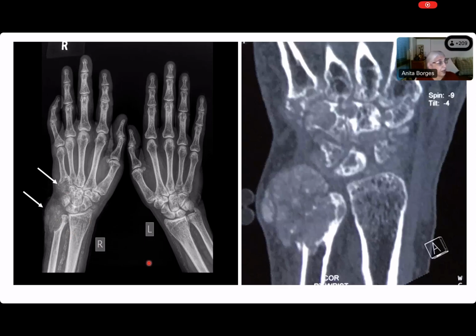We also need to know beforehand, when we look at it, whether this is a mature skeleton or not a mature skeleton, right? So is this a mature skeleton, Mansi? Yes, ma'am. How do you know it's a mature skeleton? The fusion of the growth plate. Fusion of what? The growth plate. What is that growth plate called, Mansi? At the junction of the epiphysis and the metaphysis of the bone. Yes. So what is that growth plate that we talk about? It's the epiphyseal cartilage, right? Right. Now, Mansi, how do you know that this is a mature skeleton?